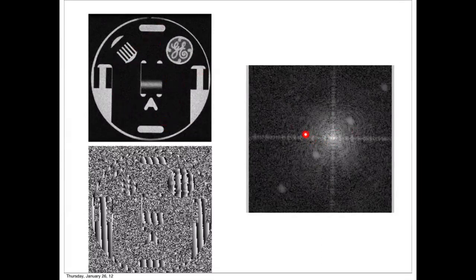So the image is pretty much robust to any shift in the frequency domain. If I look at the phase, now I can see how there is a phase across the dimension that this was shifted. Okay? Does that make sense?